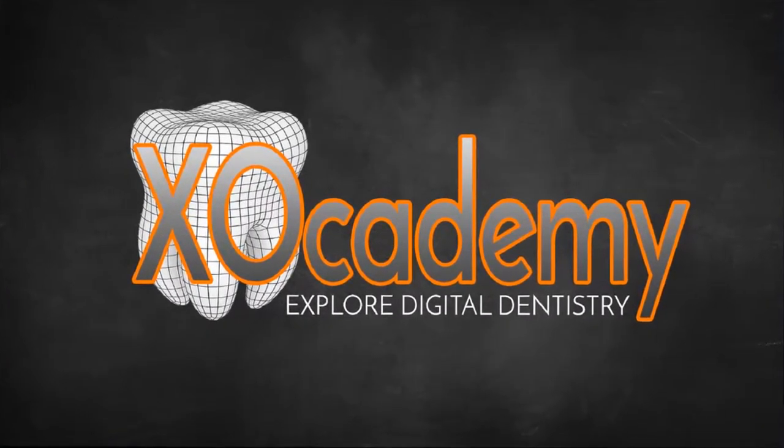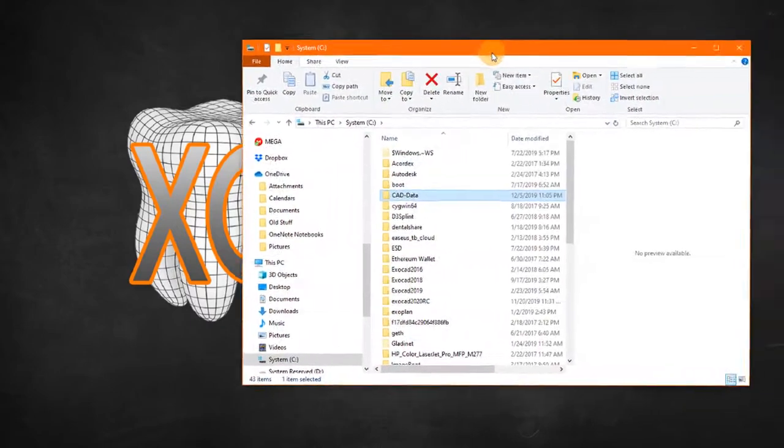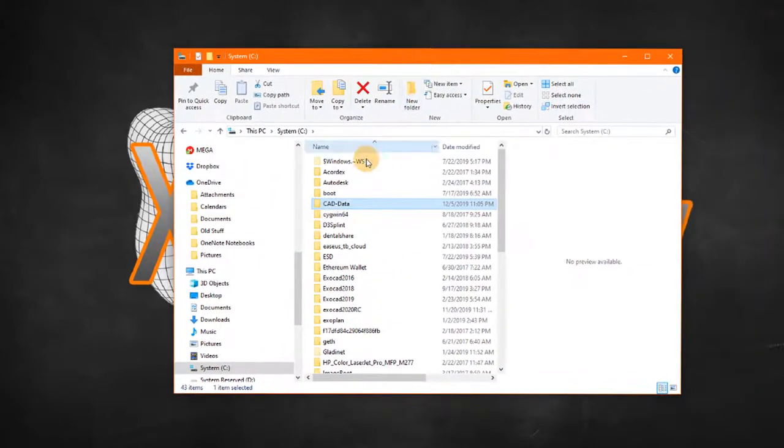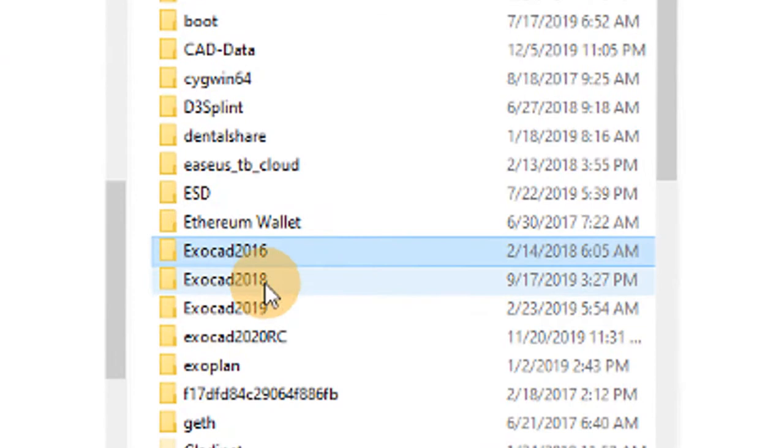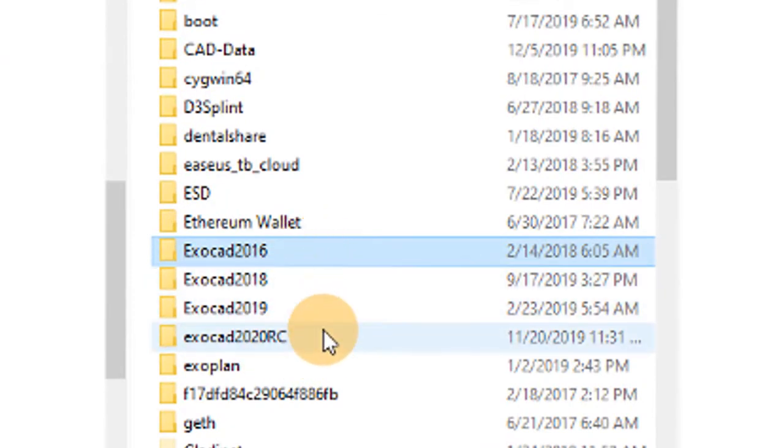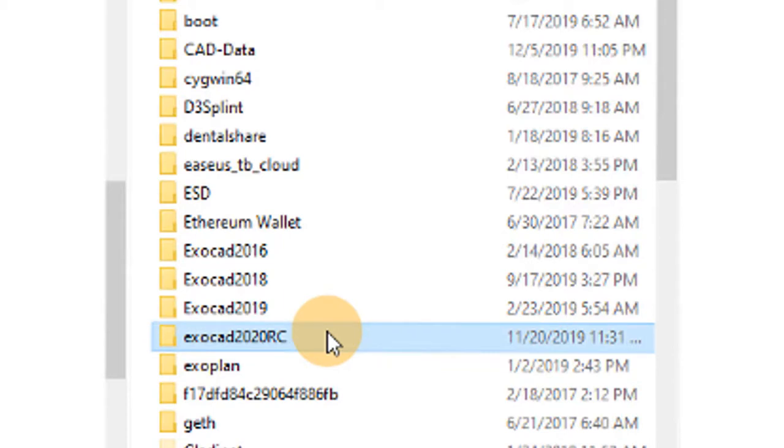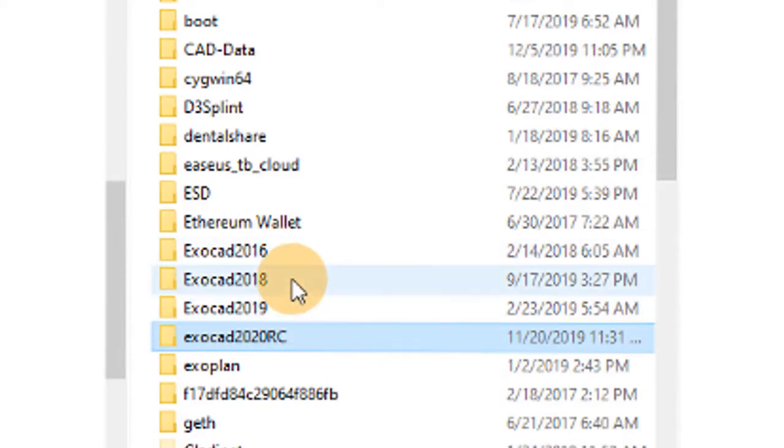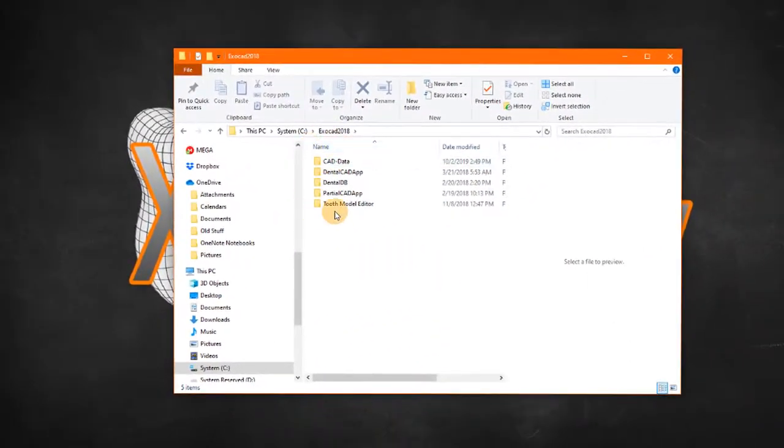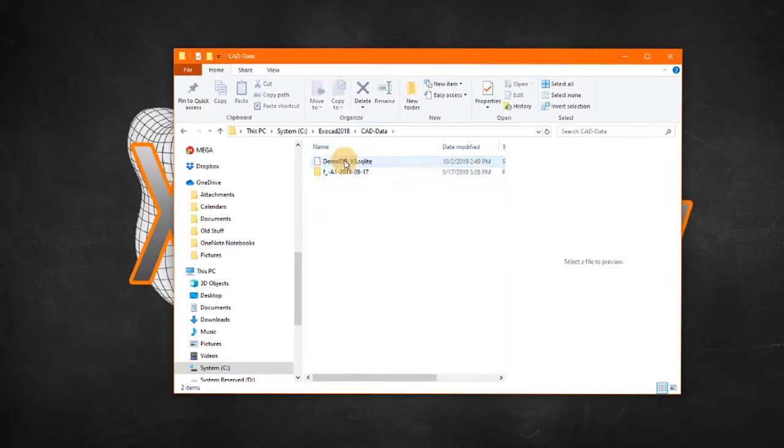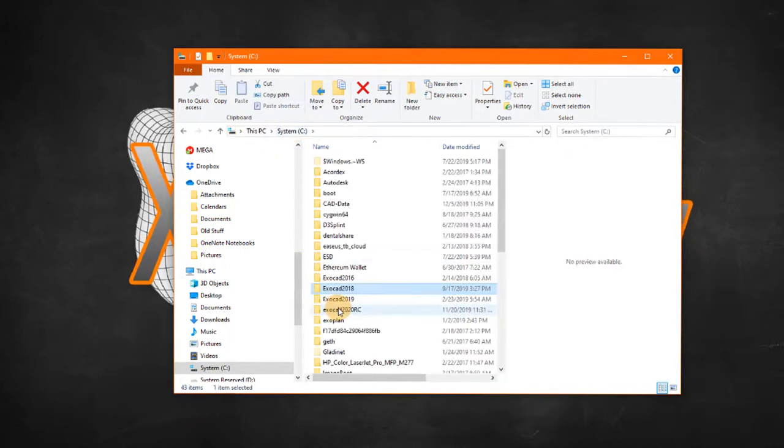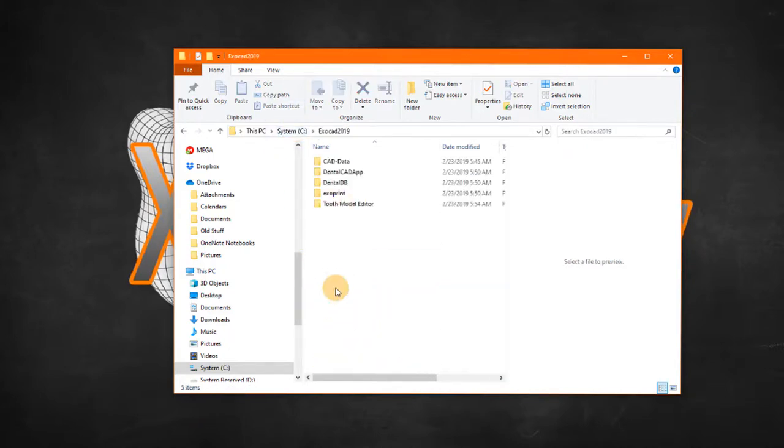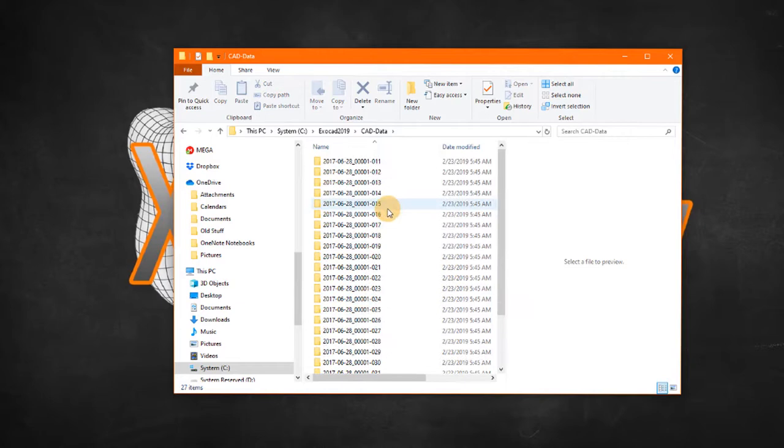So what I mean by this is I'm going to show you my hard drive here. I have right now four versions of ExoCad installed including the latest version 2.4 release candidate or beta version, but I don't want a separate database within each of these. For example the 2018 release, I don't want a bunch of patients in that CAD data folder and then go to a different version and have a bunch of other patients.